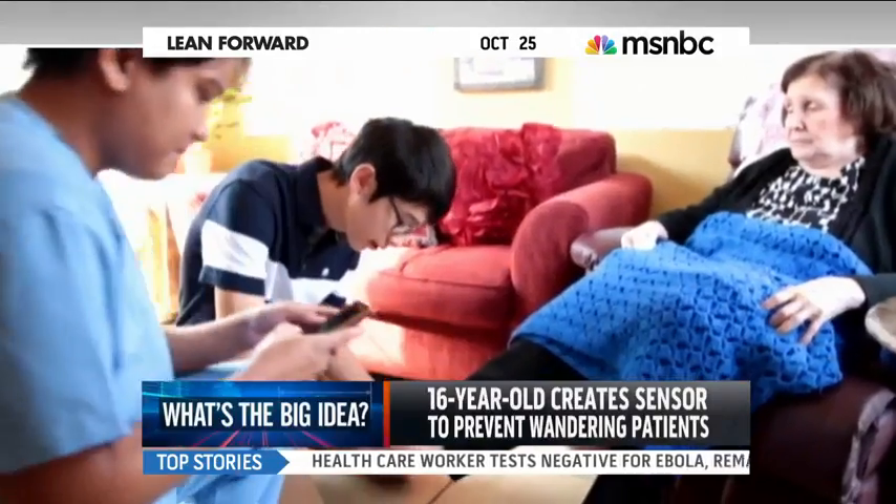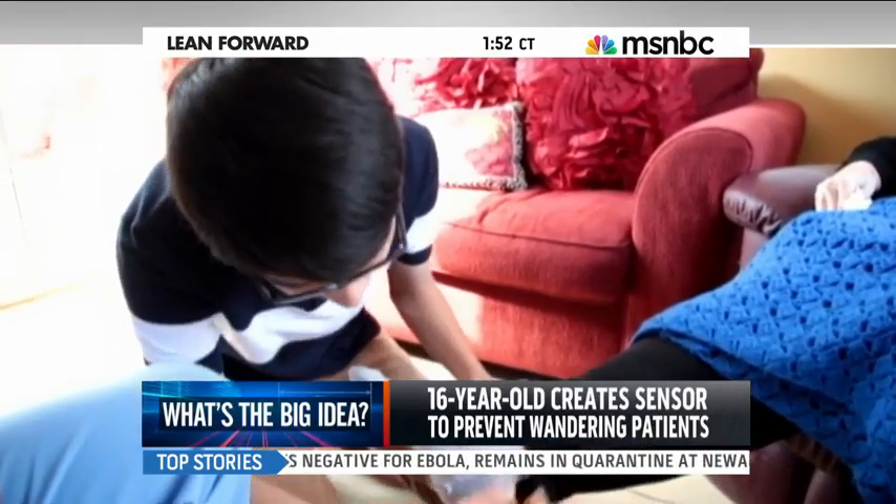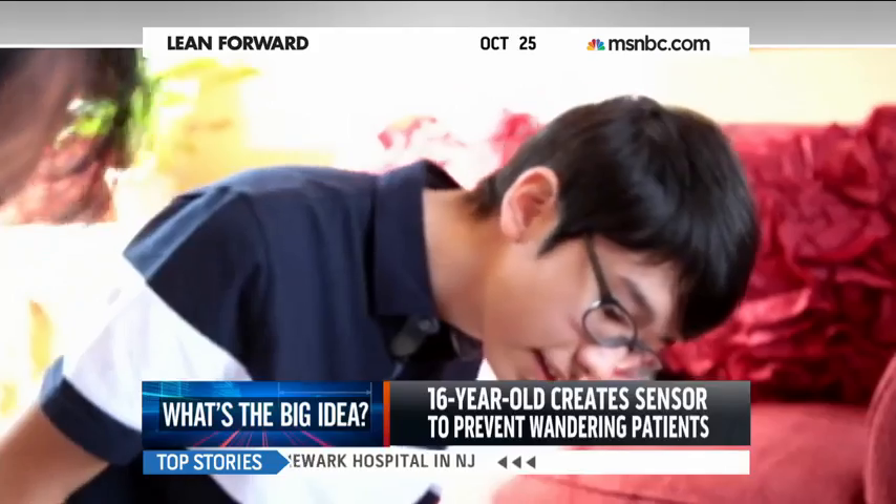Here's how Kenneth's invention works. A sensor is placed on the patient's sock. Once their foot hits the ground, an audible alert is wirelessly triggered to their caregiver's smartphone. This device took home first prize in this year's Scientific American Science in Action Award.